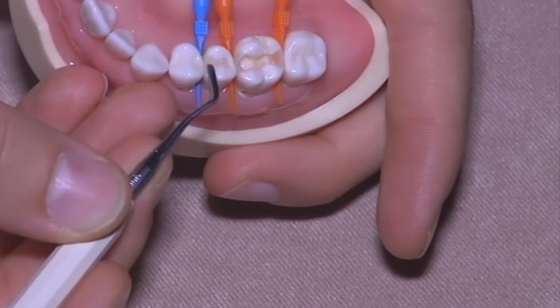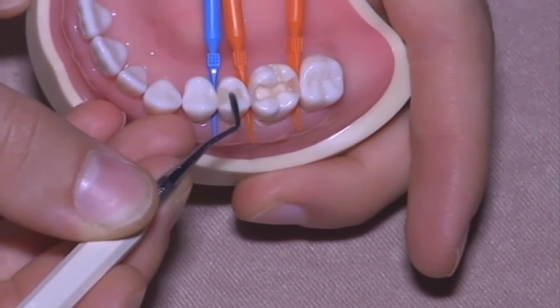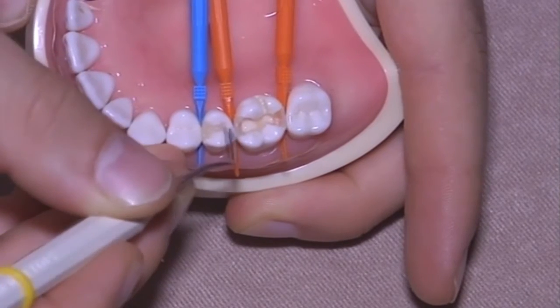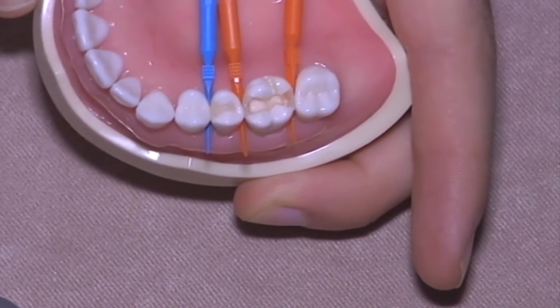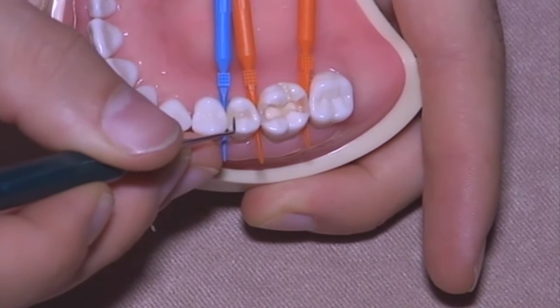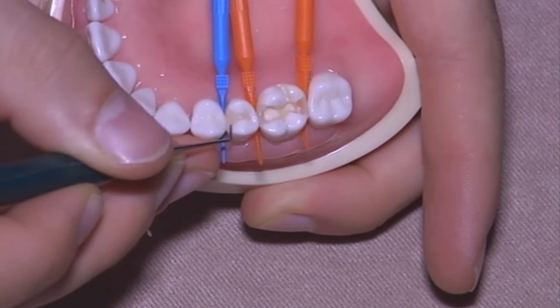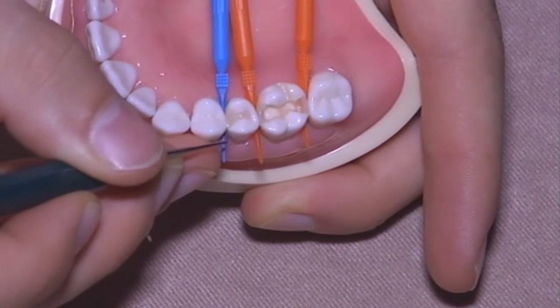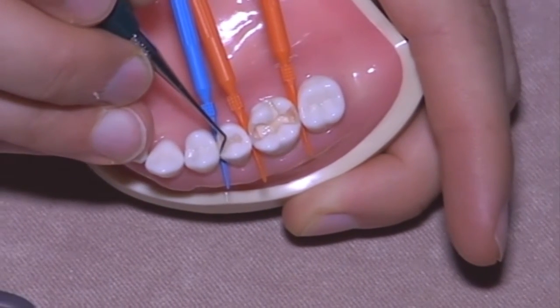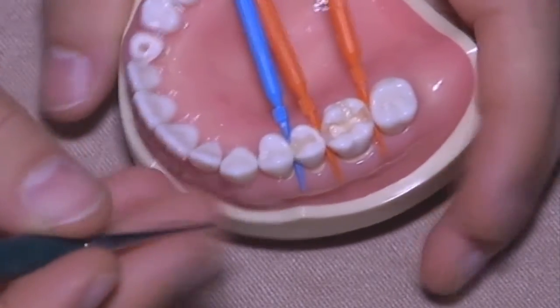Once you get the adaptation on the floor, you have to remove the excess slowly, following the residual crest. Pay attention to the composite that can drop inside the marginal area.